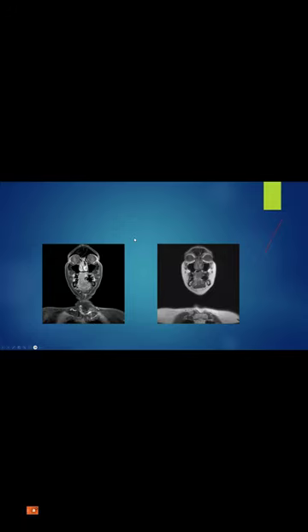Coronal T1 fat sat? No, not post-contrast, not fat-saturated. Just regular coronal T1. Sometimes you need T1 without fat saturation, just to see the bright fat compared to abnormal tissue. You might need this in the skull base, in the pterygopalatine fossa, in many applications. Sometimes if you have foramen involvement, you need to use the fat as a contrast. So just regular T1, pre-contrast.